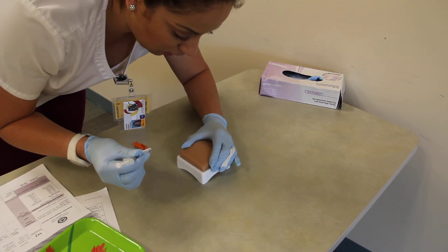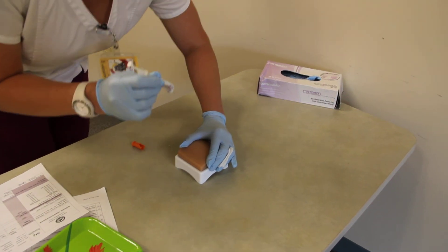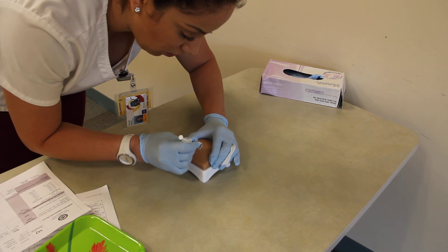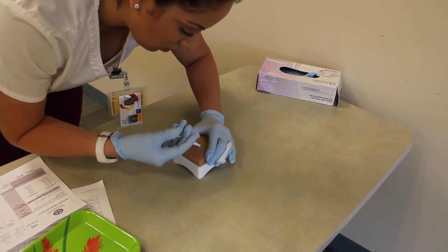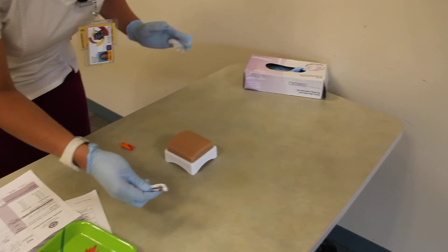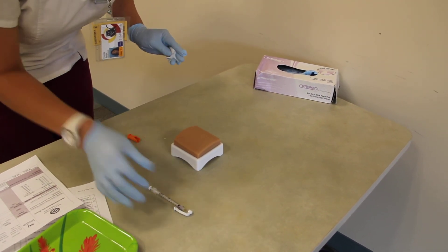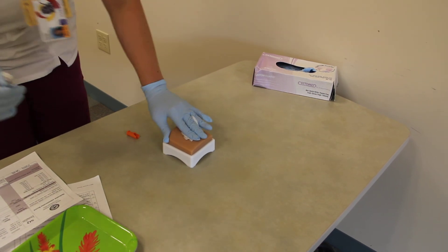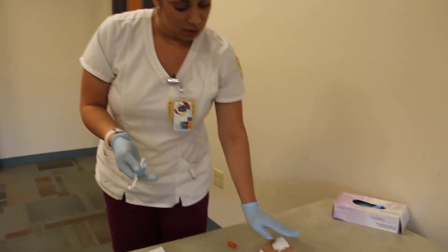I'm going to go ahead and pinch the skin I already cleaned. I'm going to go at a 45-degree angle. Okay, Mrs. Smith, on the count of three — one, two, three — and I'm going to pull it out, let go, and do my safety one-hand technique, not with two hands. I don't want to drop it on the patient. I'll put the gauze on there for a few seconds.